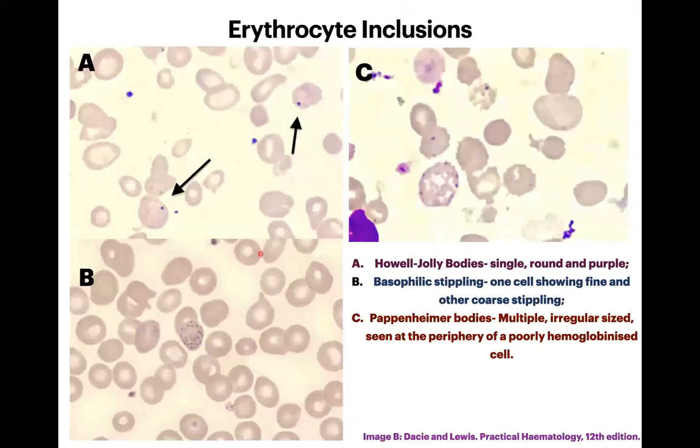So these are the 3 images showing different types of RBC inclusions. First image is showing these Howell-Jolly bodies. You are seeing that this background is of megaloblastic anemia. You are finding these macro-ovalocytes and teardrop cells, and some schistocytes, that is fragmented RBCs, and spherocytes are also there. So this is one, and this is another. They stain similar to the purple in color, similar to this, medium sized. Okay. So these are Howell-Jolly bodies.